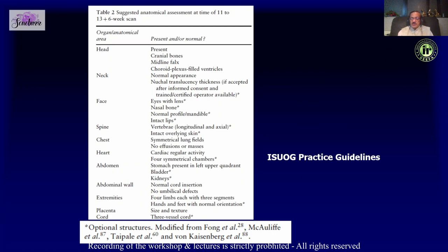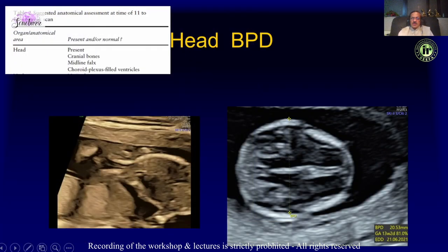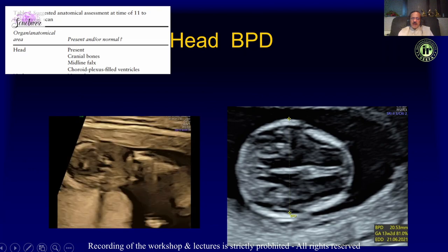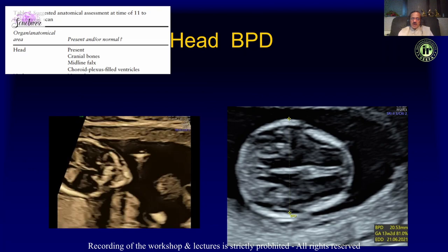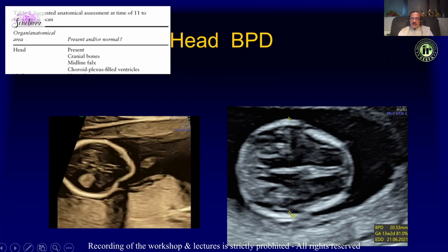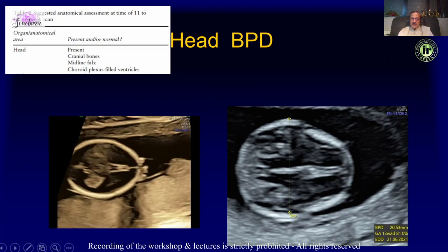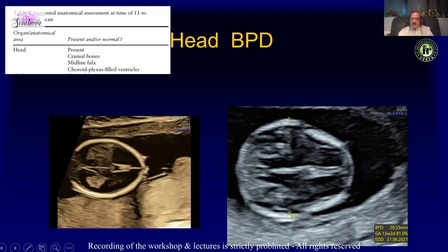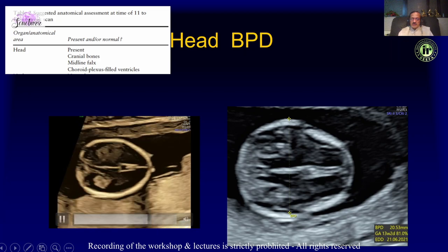We expect to see a lot of structures in the first trimester and can follow the ISUOG guidelines. Starting with the head, the ISUOG guidelines expect us to confirm the head is present, cranial bones are seen, midline falx is seen, and the choroid plexus fills up the ventricles.